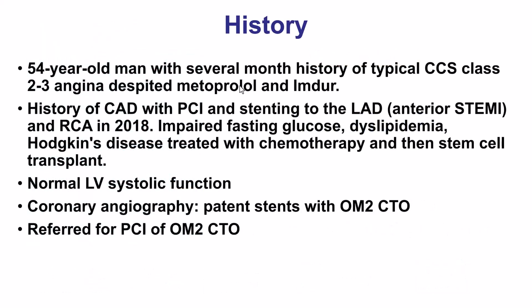The patient was a young gentleman that presented with medically refractory angina in the setting of a CTO of the second obtuse marginal branch and was referred for percutaneous coronary intervention.